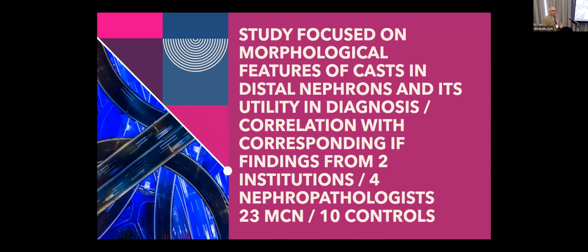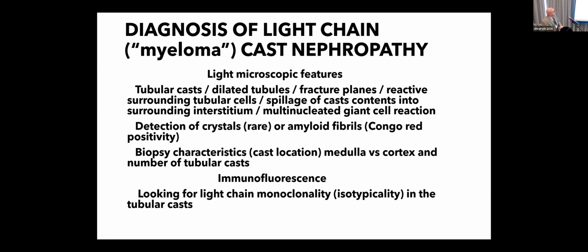I decided to get together with somebody who had a lot of cases, and that was Dr. Truong and the Methodist Hospital. And then we decided to look at 23 cases of myeloma cast nephropathy proven and compare those with cast that occur in patients with a number of other different entities to see if we could find some things that would tell us those myeloma casts, even though they may not be monoclonal on immunofluorescence, they are myeloma cast nephropathy cast.